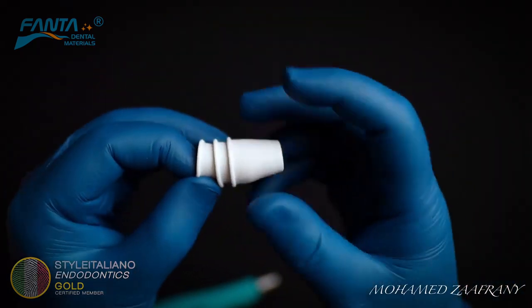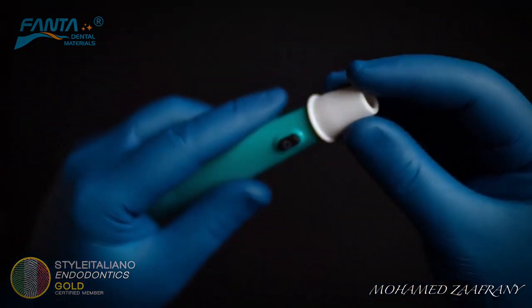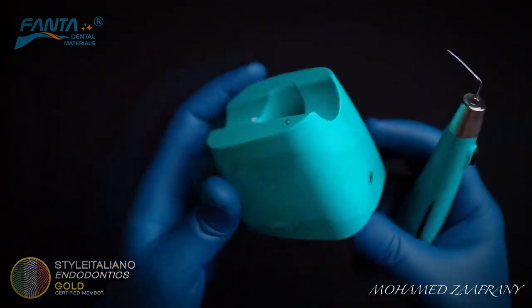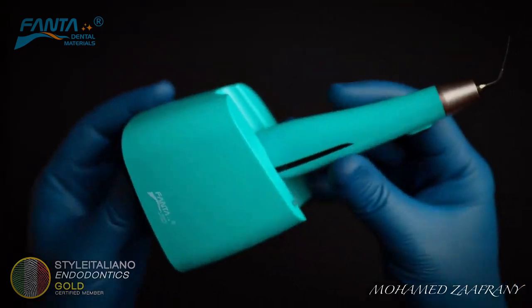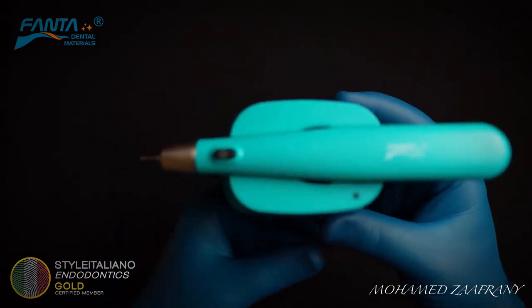The device comes with three sterilizable protecting sleeves to help in infection control. This is the charging base — here is the parking position of the device, and this is the charging position.